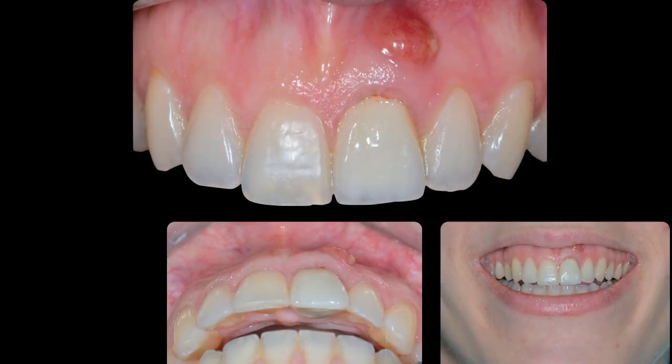So the case again is about the tooth of a central incisor of a young 24-year-old female that came in with a chief complaint of a periapical abscess on the central left incisor, as you can all see clearly on the screen. She's, of course, a very beautiful lady with a high smile line and very thin biotype, as you can clearly see here on the lower right side of the screen. She is suffering from a periapical abscess on tooth number 21, and so she wanted to see what we can do about this.